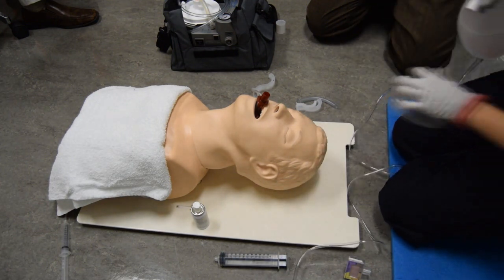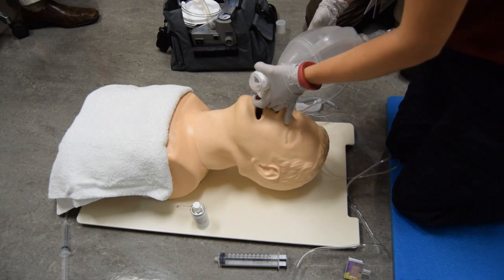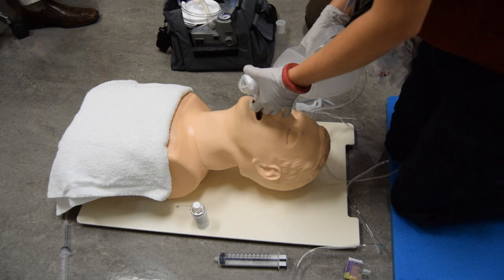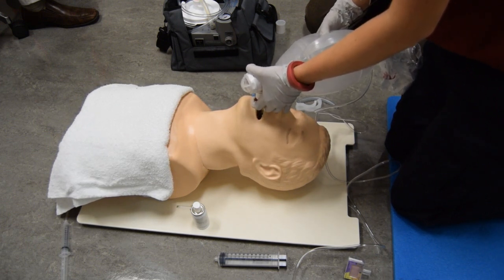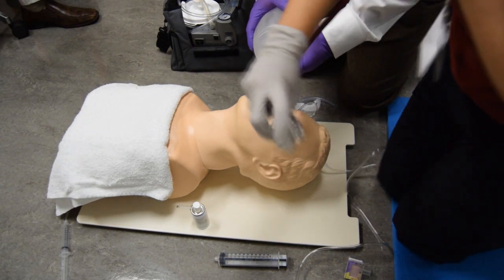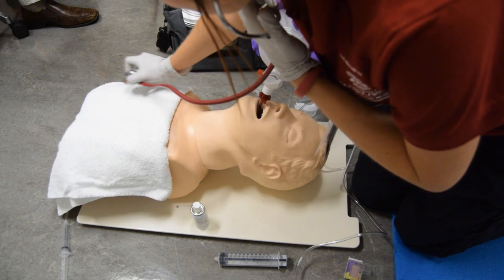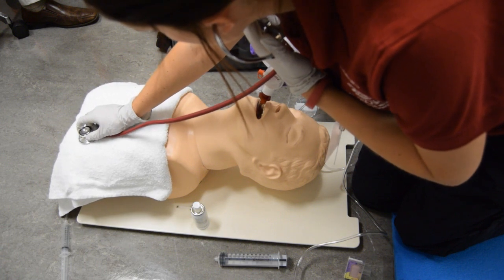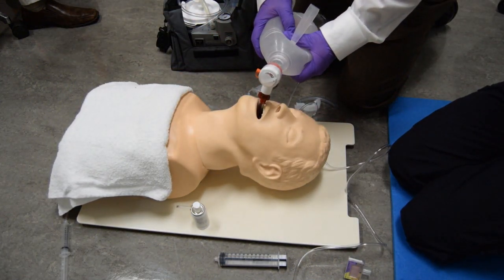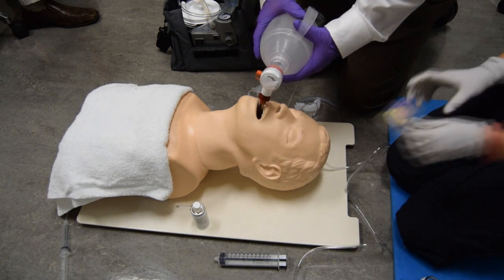Ventilates patient and confirms proper ventilation by auscultation bilaterally over lungs and over epigastrum. Pulling out as I ventilate until I see chest rise and fall. Asking partner to ventilate so I can auscultate. Auscultating for epigastric sounds and lung sounds. Adjusts ventilation as necessary; slightly withdraws tube until ventilation is optimized. Verifies tube placement by secondary confirmation such as capnography or capnometry.